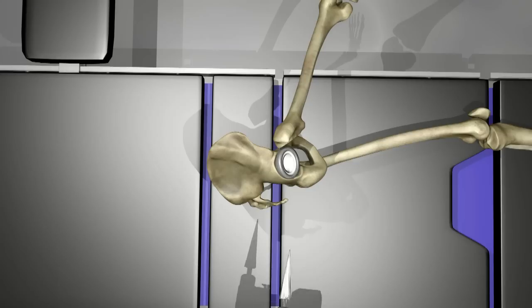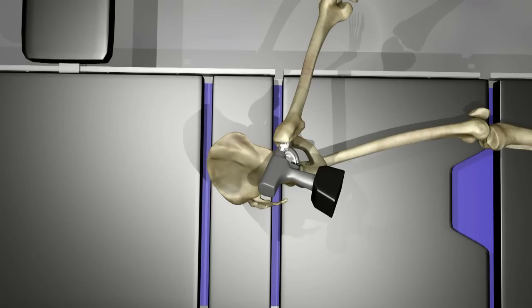The bone canal of the femur is also reamed. It is then prepared with a broach to receive the stem of the femoral component.